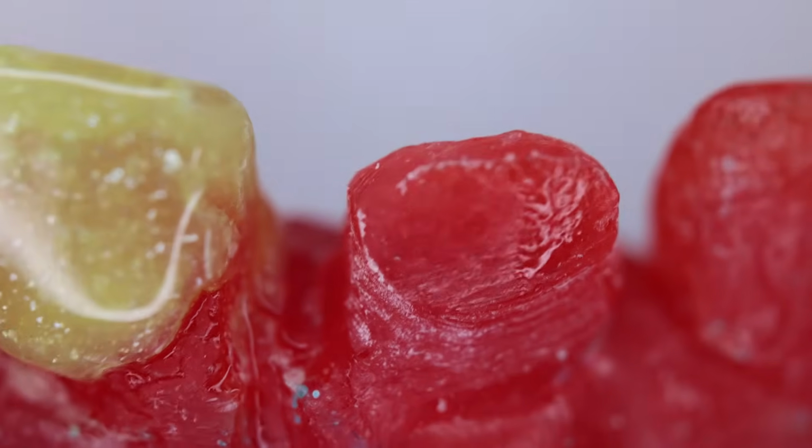Let us choose the color. Over here we have different colors, just to make this interesting on how we can add colors and place the crowns.